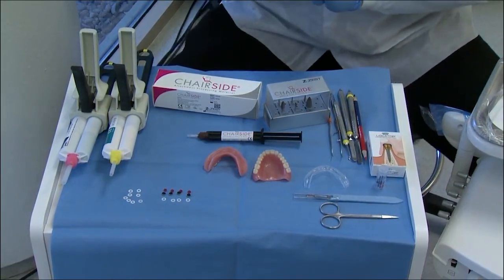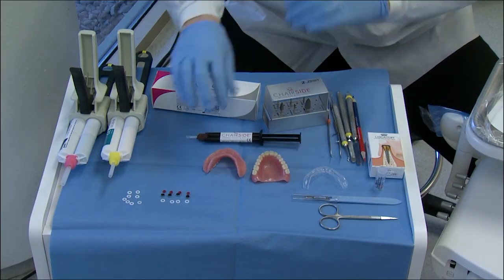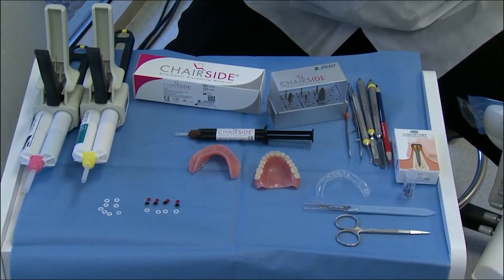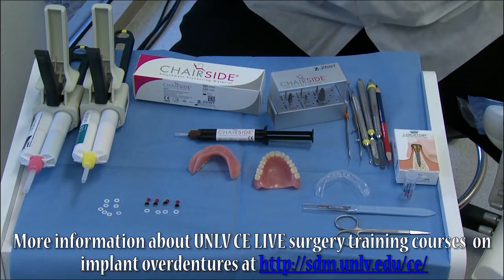Hello, this is Dr. Michael Shear with Learn Lodi. This is a clinical technique demonstration video highlighting the new Zest Chairside Denture Prep and Polish Kit. What we're going to be doing in this video is demonstrating converting this mandibular complete denture into an implant overdenture. Four Zest Lodi implants were placed in the anterior mandible as part of a training course at UNLV School of Dental Medicine with Dr. Ingle.